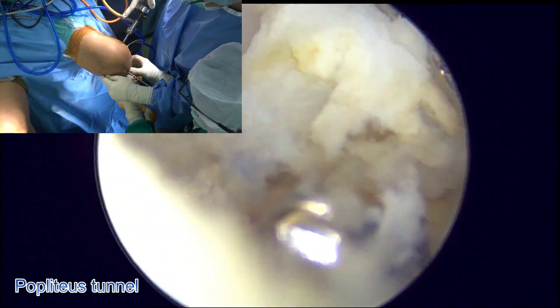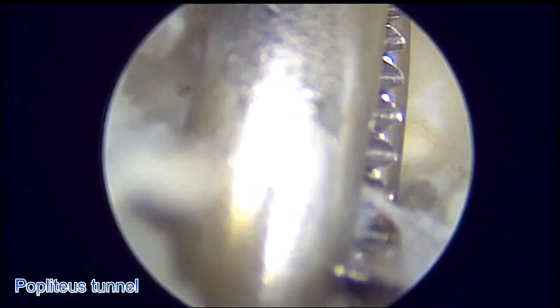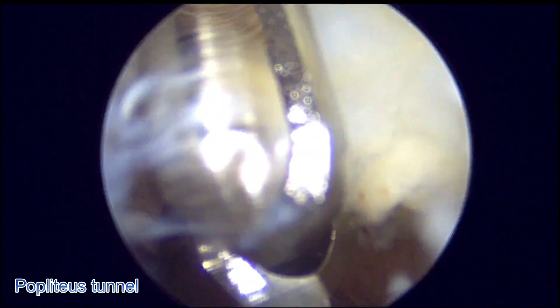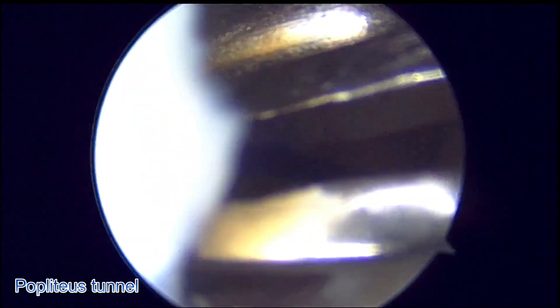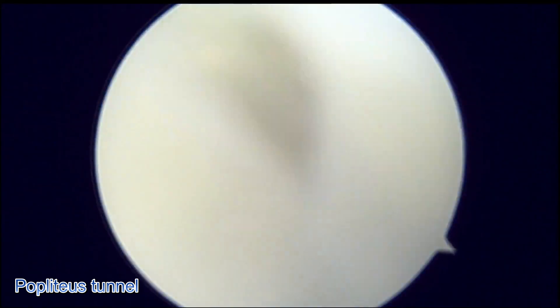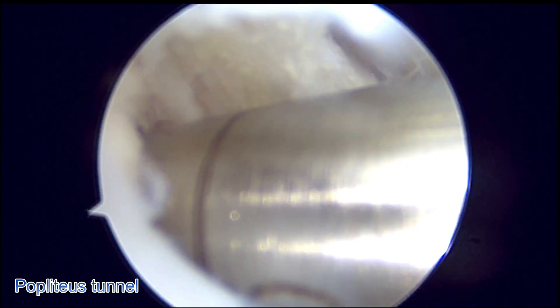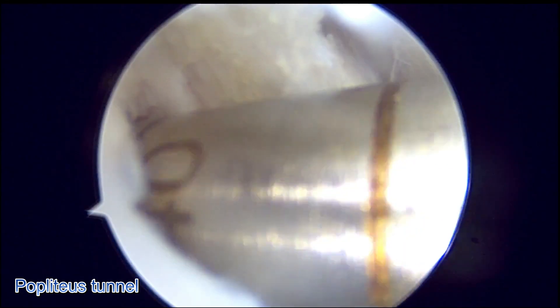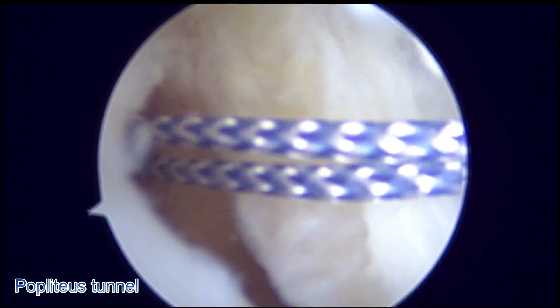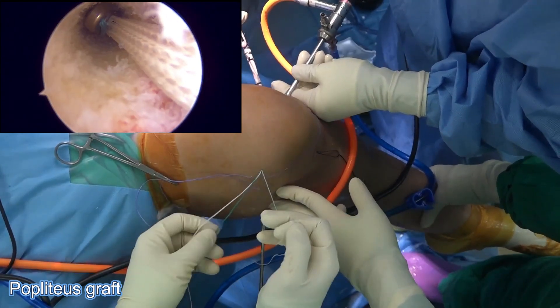The tibial tunnel is then created using retrograde drilling. We will now leave a shuttle suture in place for later. The femoral tunnel is drilled to 40mm and shuttle sutures are placed. The popliteus graft is shuttled through the femur and the tibia.